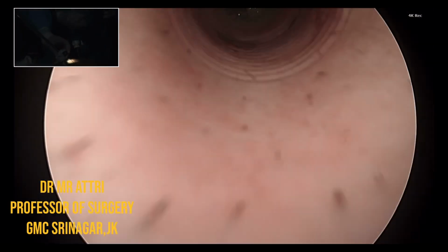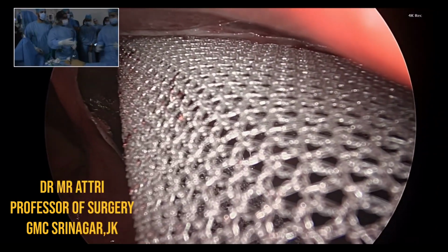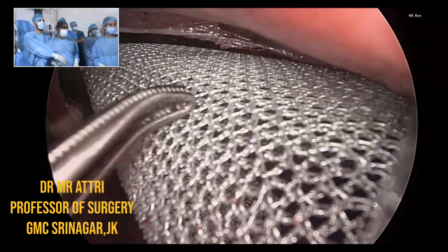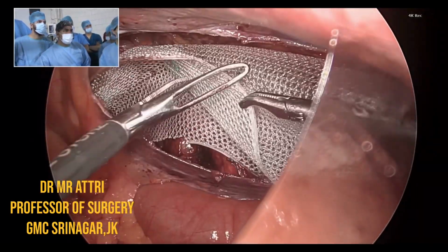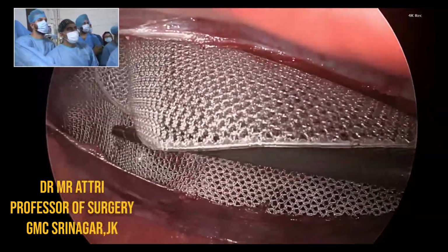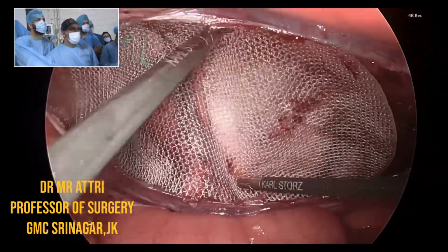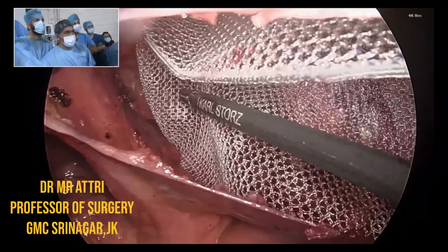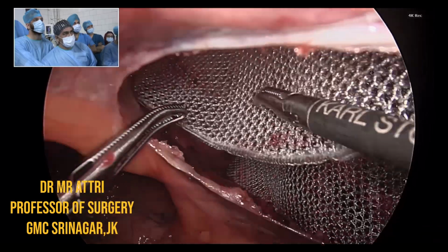Can we know the reason why you have chosen this mesh? This is an anatomical mesh where it conforms to the contours of the pelvis, and this is the macroporous mesh, anatomical mesh made for right side and left side both. You can see how it spreads. We are using almost 15 into 12 centimeter mesh, so this spreads very nicely, and since it's a macroporous mesh, we have to go across the midline, at least 2 centimeters across the midline. So that's the medial edge of the mesh.